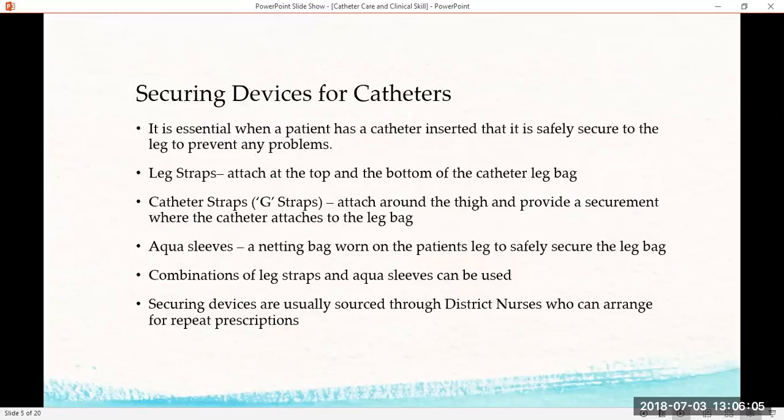So the aqua sleeve measuring, that should be done by the staff, and that would indicate what size they would need to get. Yeah, they come in different sizes due to the patient's leg width. So you might have some frailer old ladies who've perhaps got a thinner leg, so you'd be looking for a smaller size for them. And then people who've perhaps got a larger leg circumference is perhaps the word I'm looking for, who'd need a bigger size. Okay, no problem.